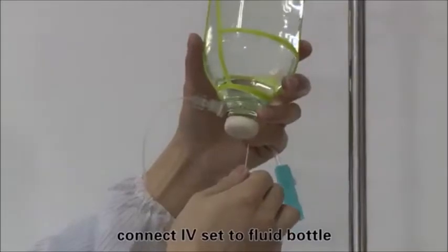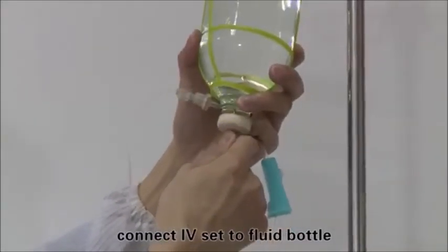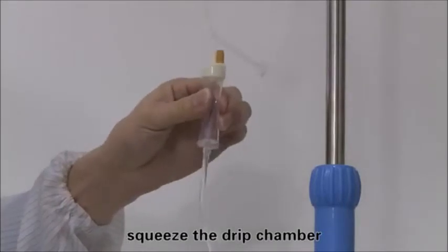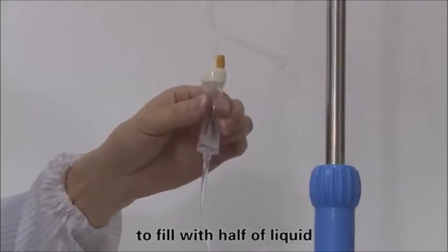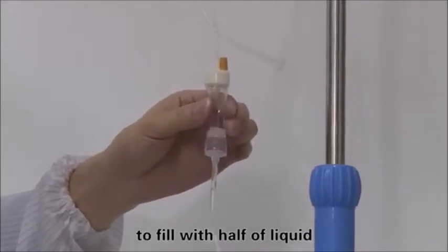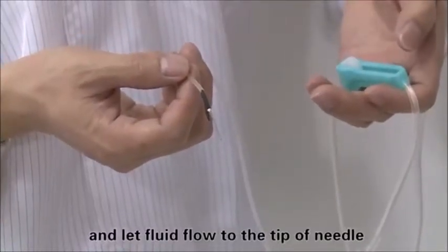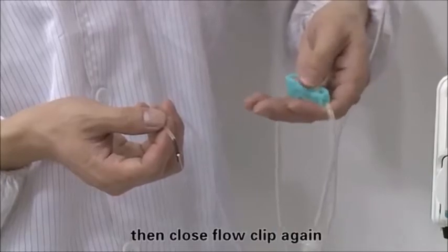Close the flow clip, then connect the IV set to the fluid bottle and insert the intake pipe. Squeeze the drip chamber to fill it halfway with liquid. Open the flow clip and let fluid flow to the tip of the needle, then close the flow clip again.